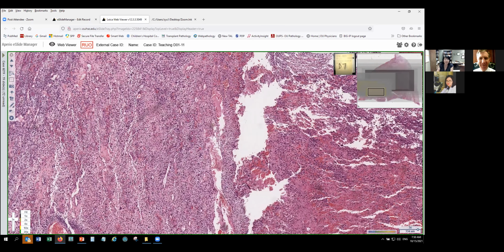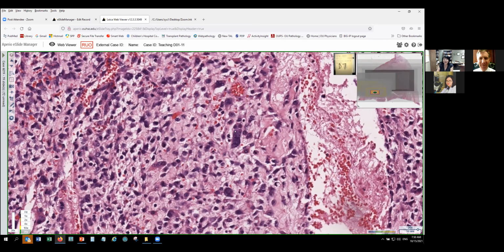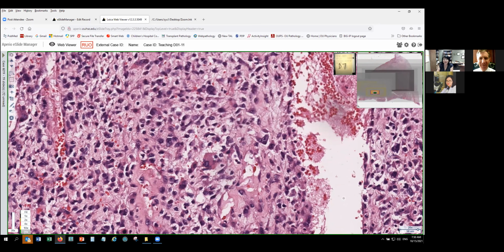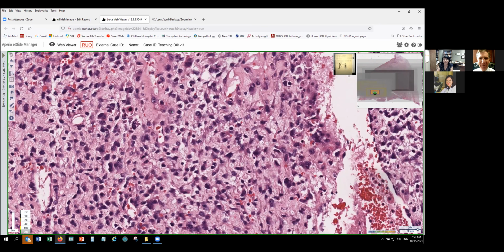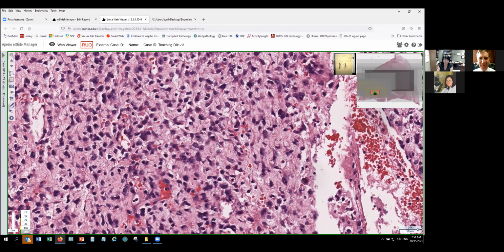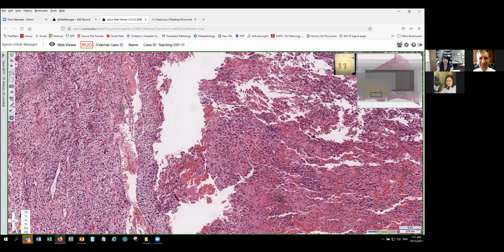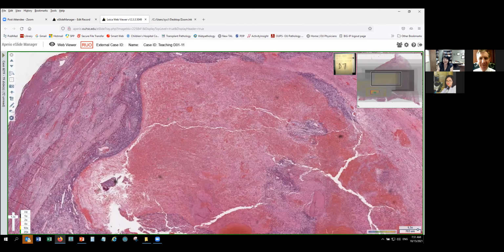And you look at the tumor morphology. They're more like spindle cells, pleomorphic, with some very large atypical cells. Some have a cytoplasm with pink granules. And there's no epithelial differentiation. So very pleomorphic, and mitosis is very prominent. And that's necrosis. Try to avoid this necrosis, try to avoid this area.